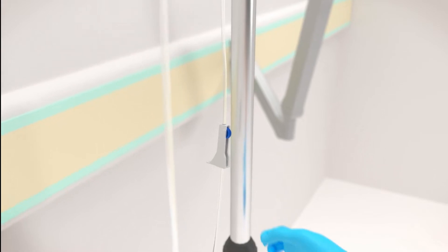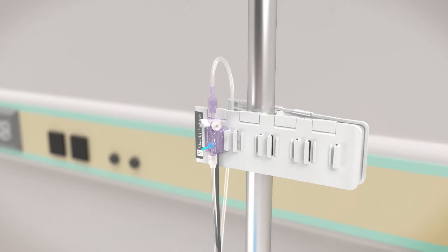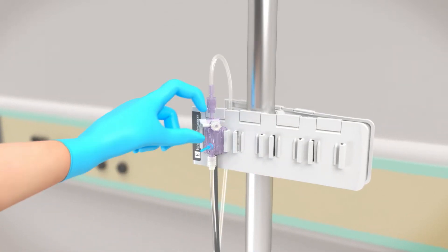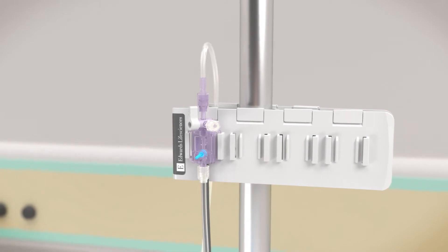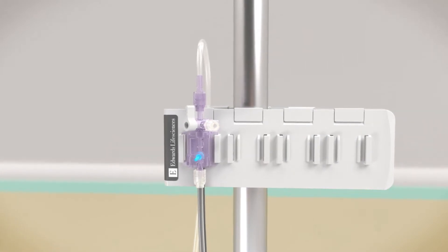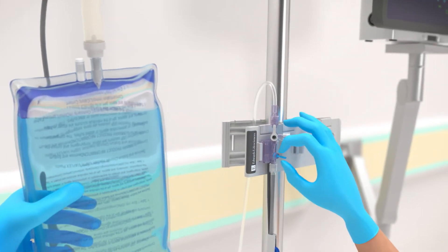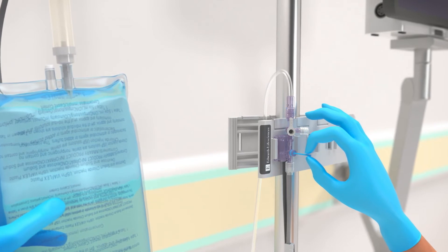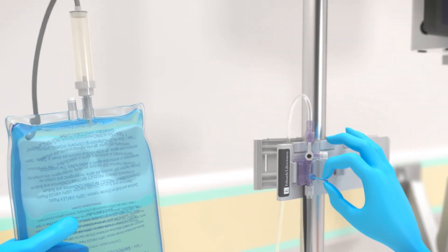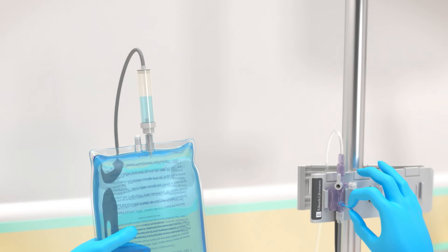Open the roller clamp on the IV set. Open the vent port by turning the stopcock toward the patient's pressure tubing and away from the transducer, while leaving the vented cap in place. While keeping the IV bag inverted, gently squeeze air out of the bag with one hand while pulling the snap tab flush device with the other hand, until air is emptied from the IV bag and the drip chamber is filled at least halfway, or per institutional policy.